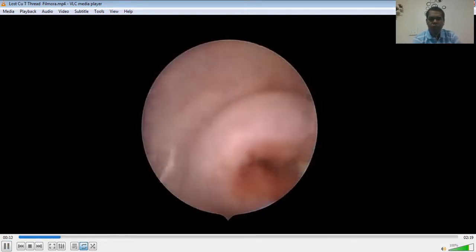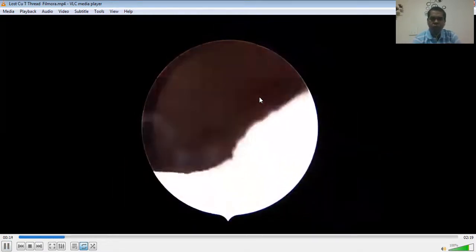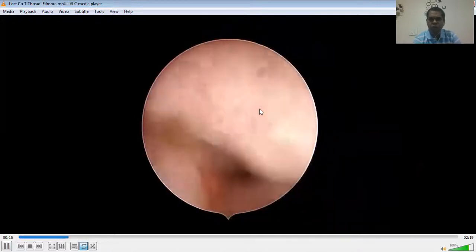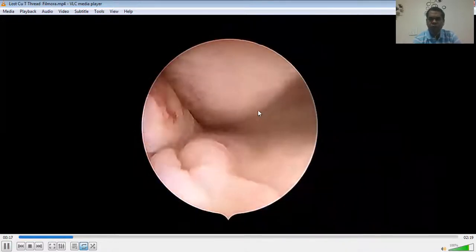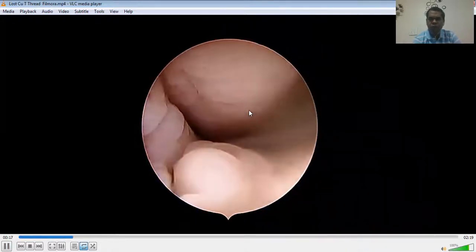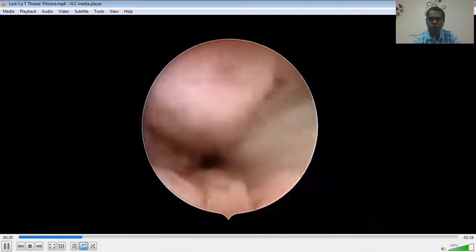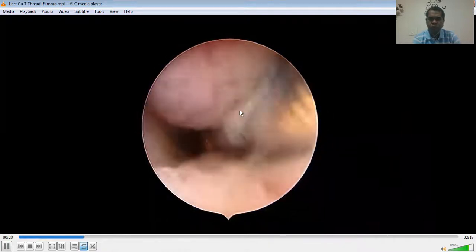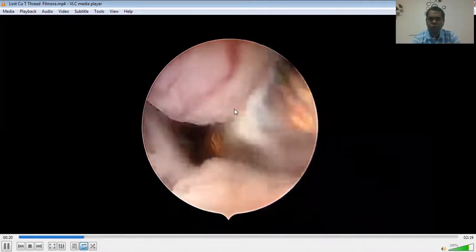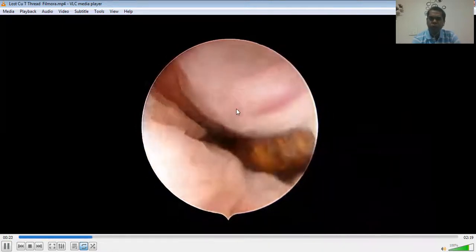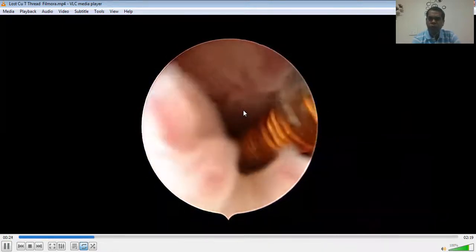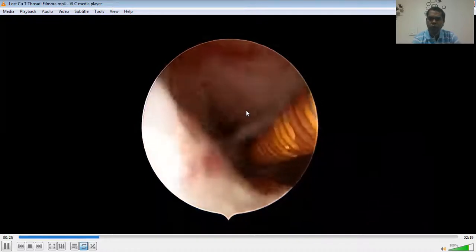Now this is the vaginoscopic approach. Now we are at the external os. Now we are near the internal os, one can notice the copper T.